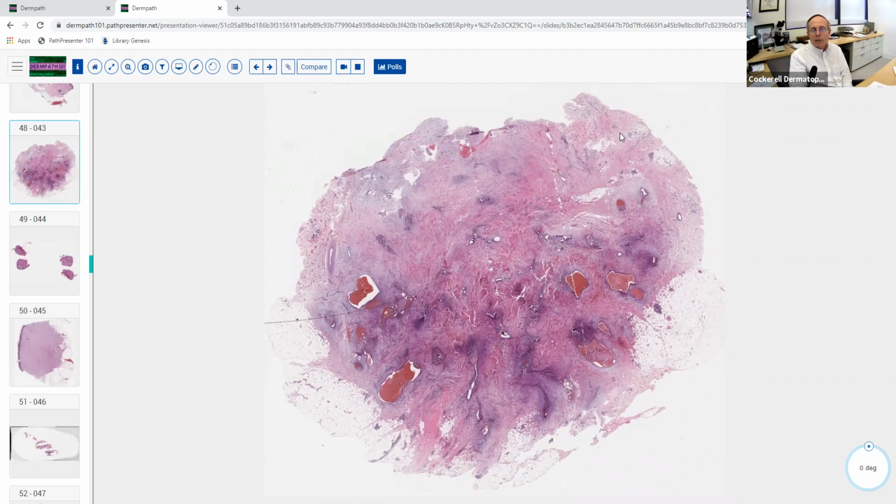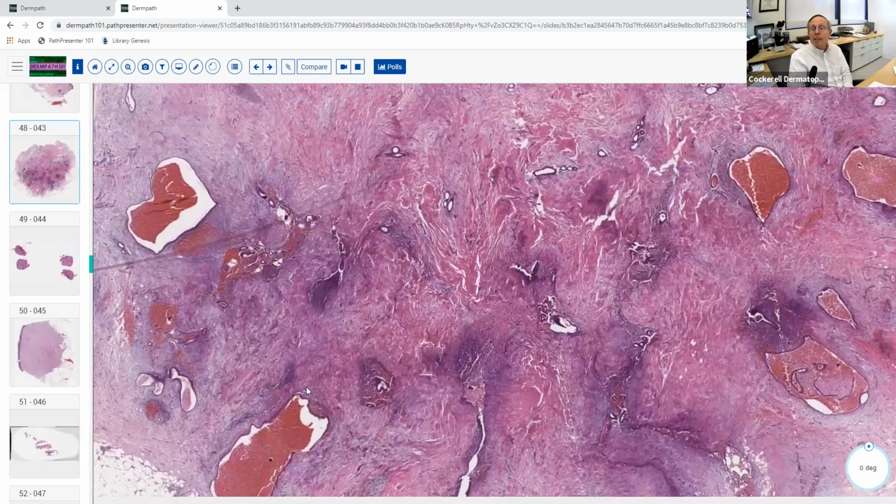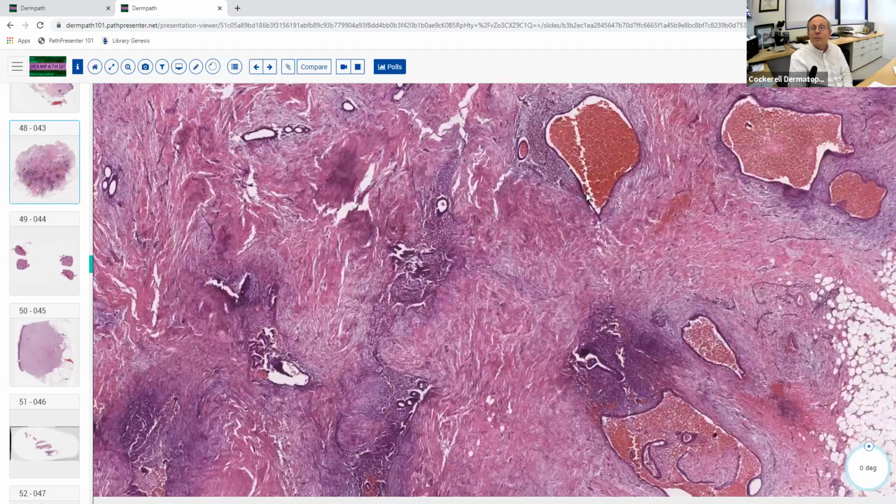So we've got what looks like maybe another incisional biopsy, maybe some kind of an enucleation biopsy. We've got a lot of spaces plus red. We think of vascular possibly in that situation. Something's bloody here. So we're going to go to higher magnification. And indeed, we see all this blood in here, but we start looking at even higher magnification.